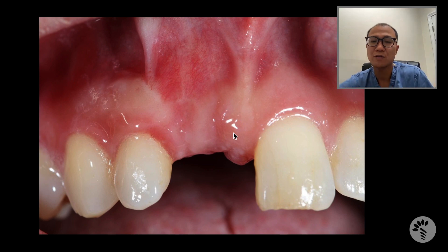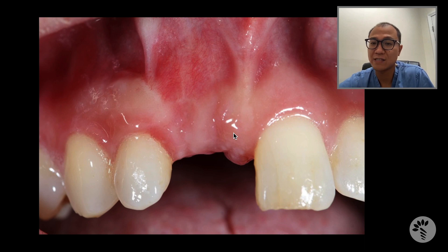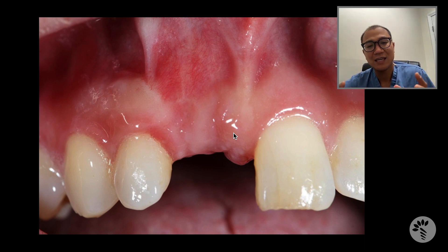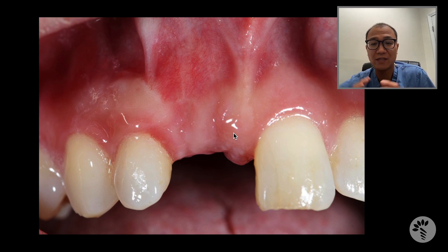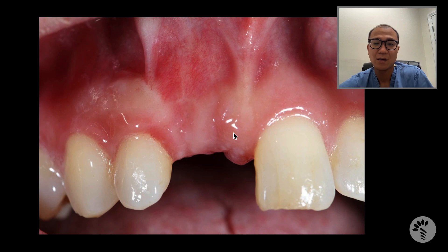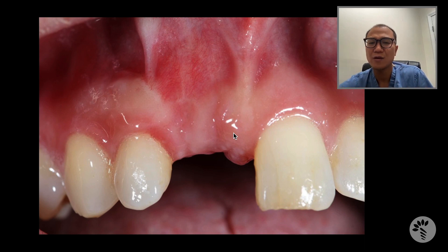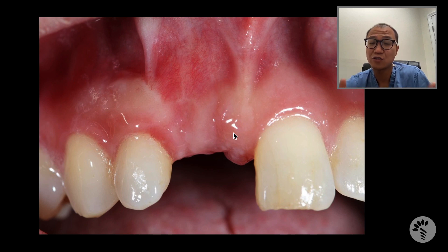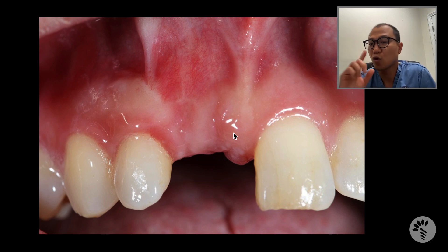This is how it looks preoperatively before I start making an incision. When I look at this case, the soft tissue around the adjacent teeth — the maxillary left central incisor and maxillary right lateral incisor — the soft tissue healing looks excellent. One thing I don't want to do is cause gingival recession around these adjacent teeth with my incision.